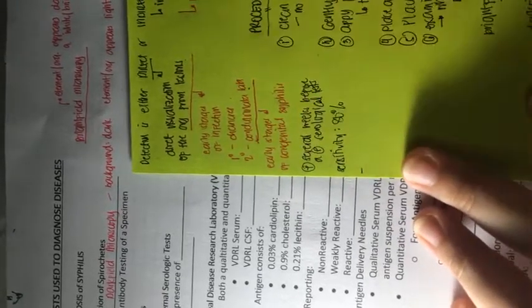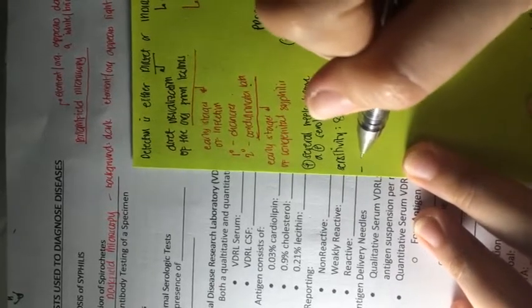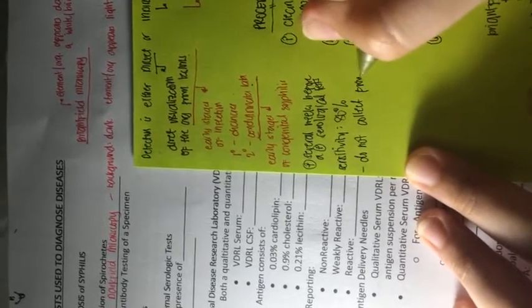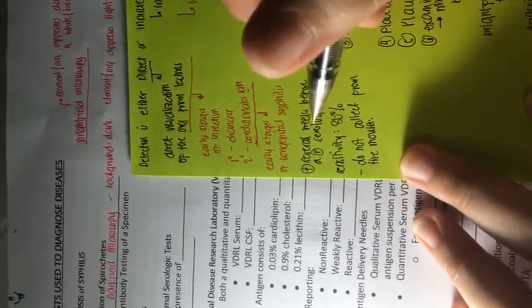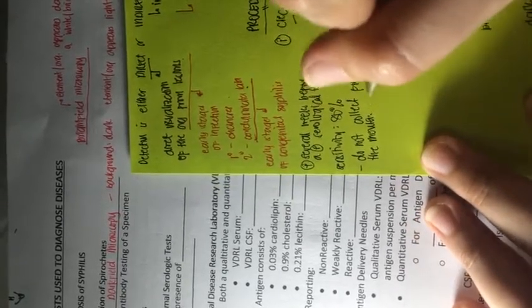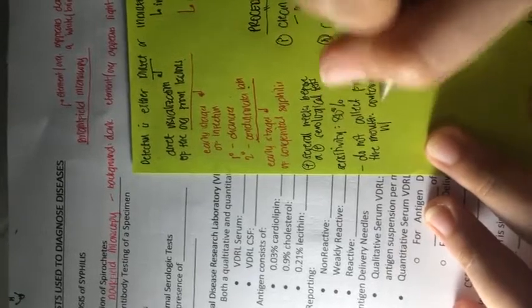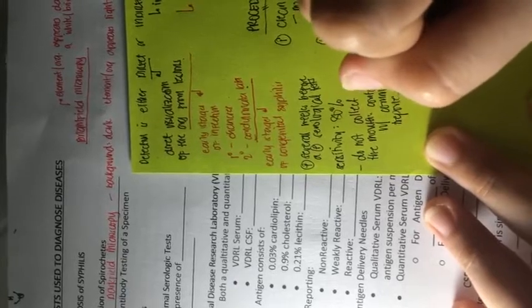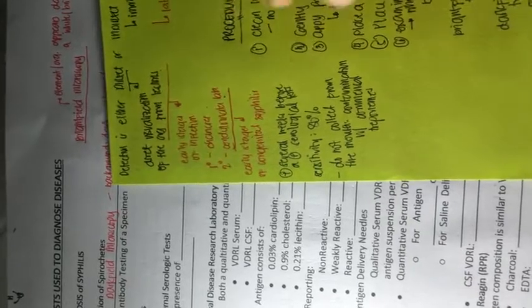One thing that we should remember when collecting specimen or lesion exudates for direct microscopy is that we should not collect from the mouth. Why? Because there might be contamination with commensal treponemes. So we have commensal treponemes. These are treponemes that are part of our normal flora.